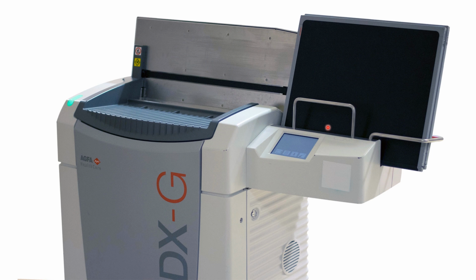So I was talking about those CR processors and that X-ray plate. That's what one of those plates looks like. This is a photo that I took from my department and got rid of all the IT information. So this is your typical AGFA processor. It's just a variation on the manufacturer: Fuji, Canon, Toshiba, Philips, Samsung, I believe, actually do them now. The AGFA is very popular.